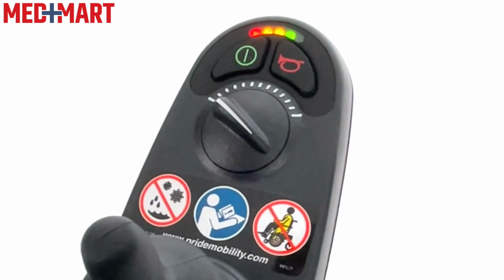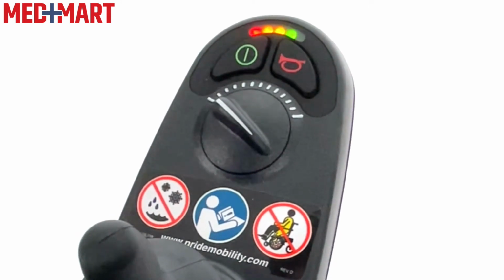So I have a speed control here. If it's all the way to the far left, basically the throttle is really throttled back, so it allows me to move slowly around a crowded situation. And if I want to go full speed, which is just under 4 miles an hour, I can turn it all the way to the right, and now it allows me to move a little faster. So if I'm out and about during the day and I'm going along with someone who's walking next to me, I can kind of match their pace and then just use the joystick all the way forward, and that way it makes it really easy to travel with people.